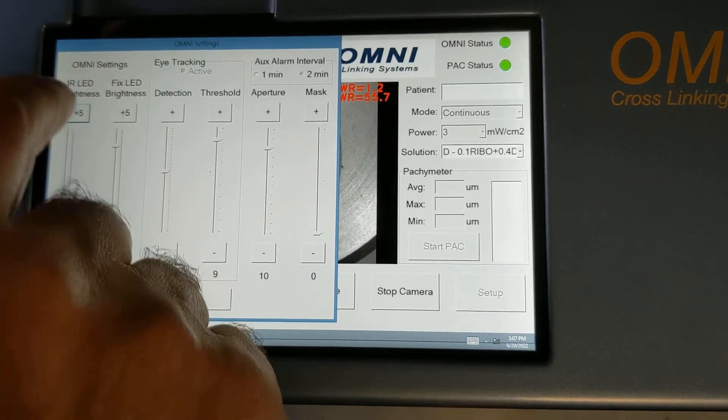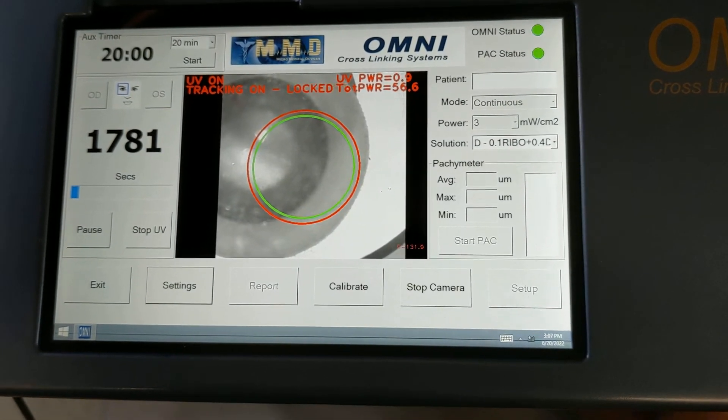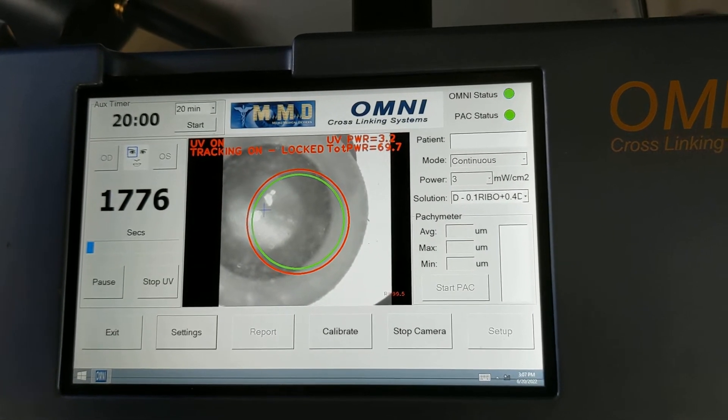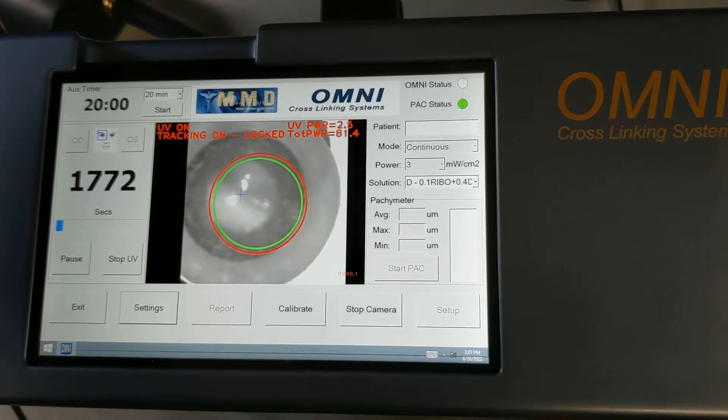If I increase the IR, the camera sees the eye much better.